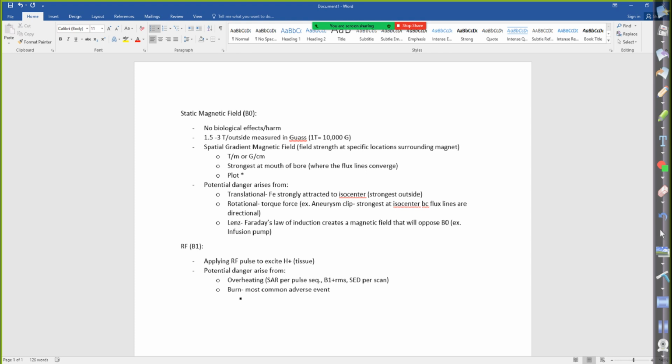All right, we had 4 types. What were the 4 types? Proximity burns. Proximity. Okay, and that's really just dealing with tissue in the near field. Remember that?